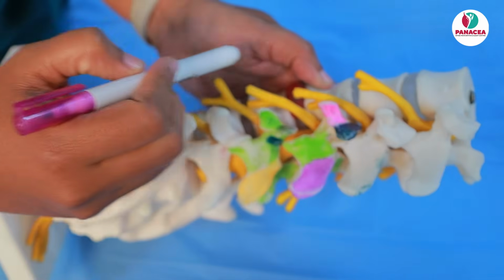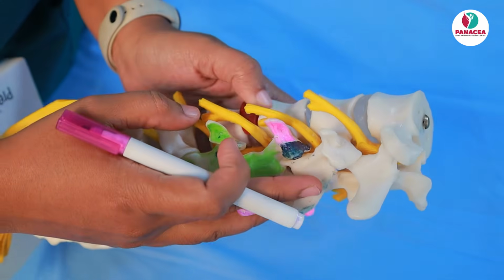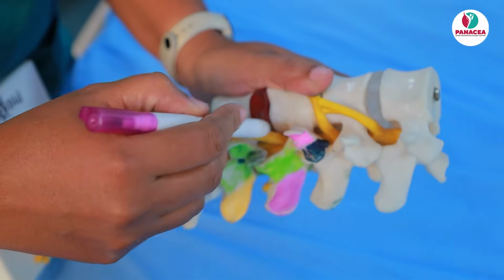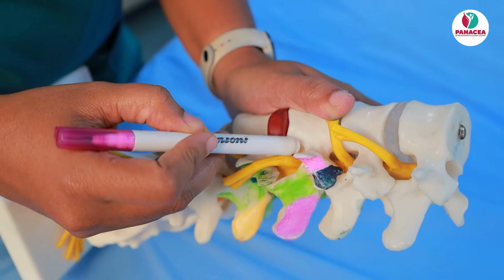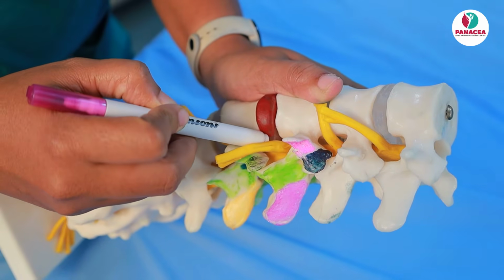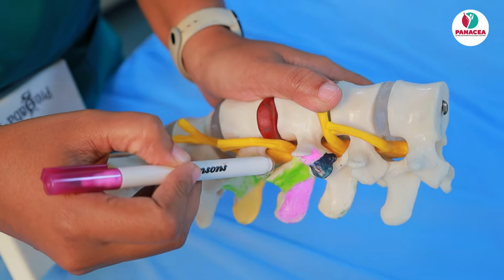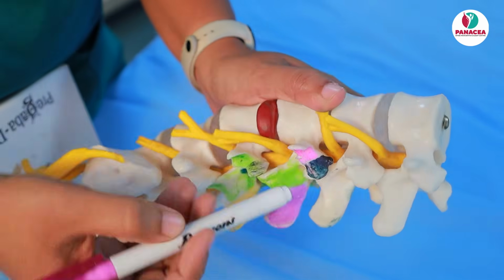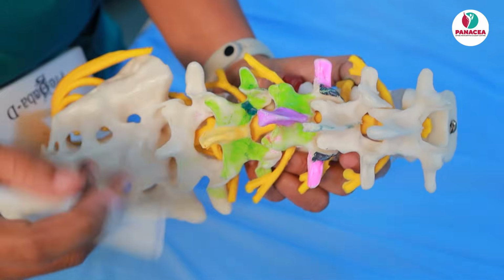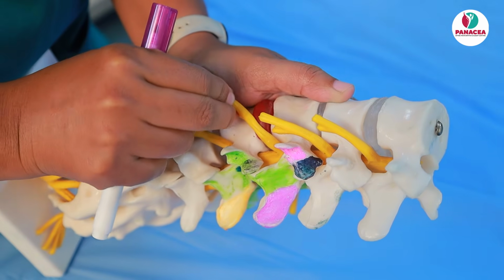Basically these are the vertebral bodies, the anterior elements, and this is the posterior elements. In this procedure we are entering into the foraminal anatomy. Anteriorly there are the upper vertebral body, the lower vertebral body, and the disc. Posteriorly there is the lamina and the facet, that is the IAP and SAP. This will form the posterior border. Medially there is the dural sleeve, and laterally there will be the fascia and the psoas muscle. So this is the anatomy of the foramen, and the nerve will come out of there and then go anteriorly.